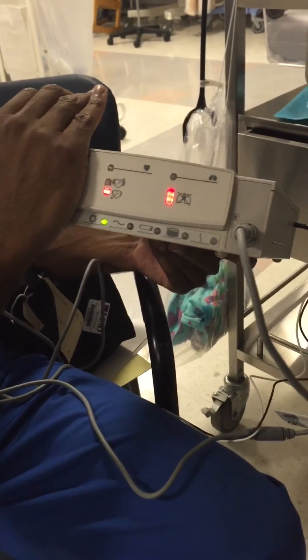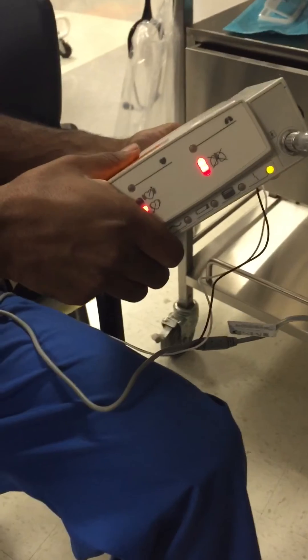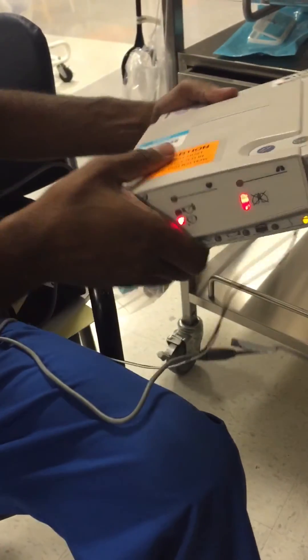The only one that's going to sound different is the disconnect. I'm going to show you what that sounds like right now — it's just a continuous beep. It stays on until you fix it, and then it stops.